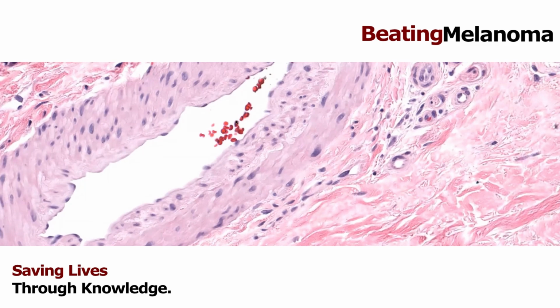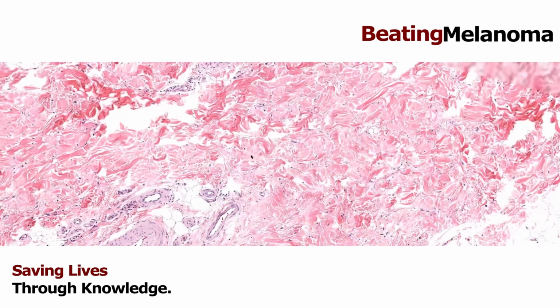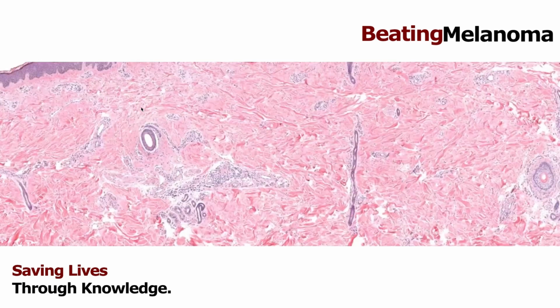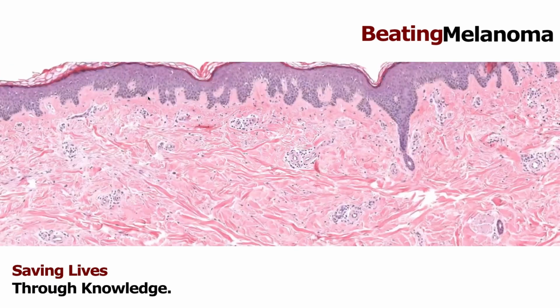Very cool. So now we've got a sense of what normal skin looks like. Should we flip over and switch to a slide showing melanoma in situ?